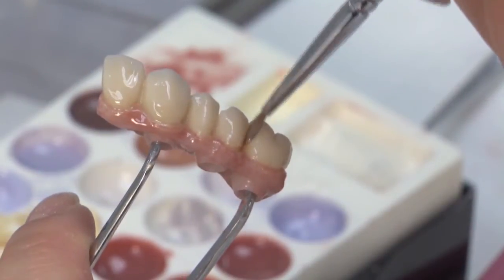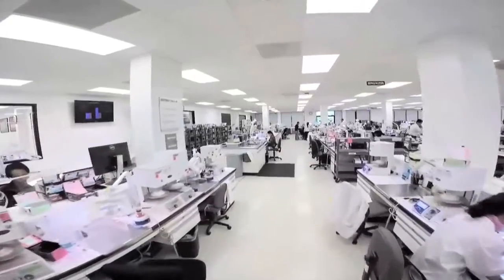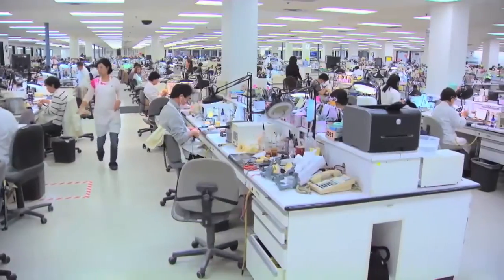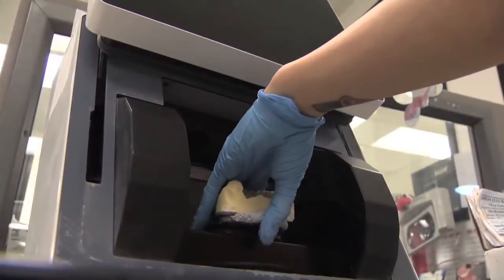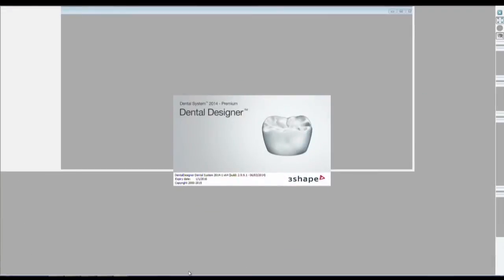From a laboratory perspective, the fabrication process incorporates meticulous quality control standards from the moment the lab receives the prescription from the doctor. After pouring a MasterCast from the final impression, a series of scans is taken and CAD software is used to design the implant prosthesis.